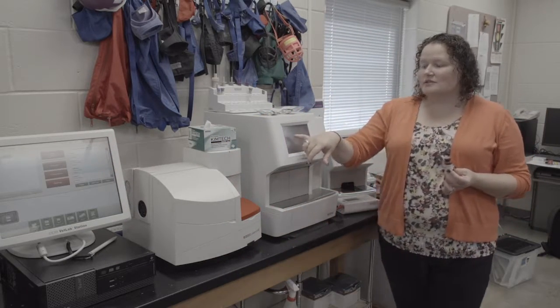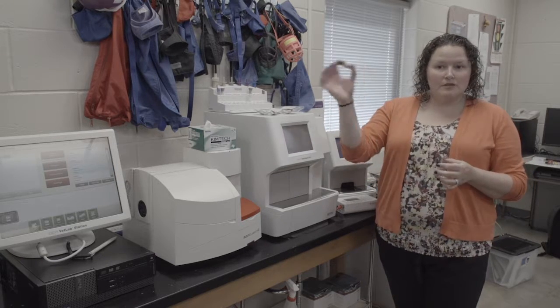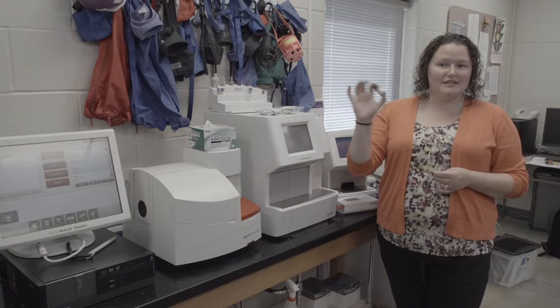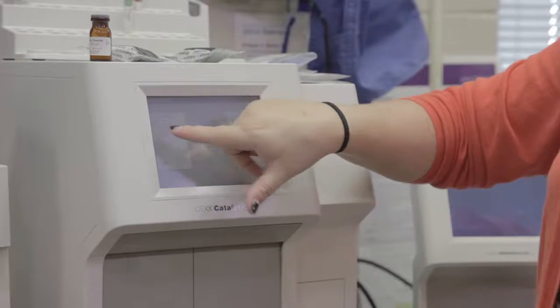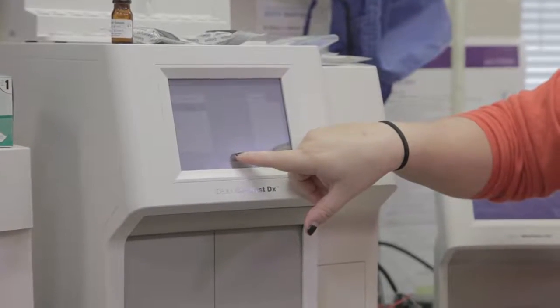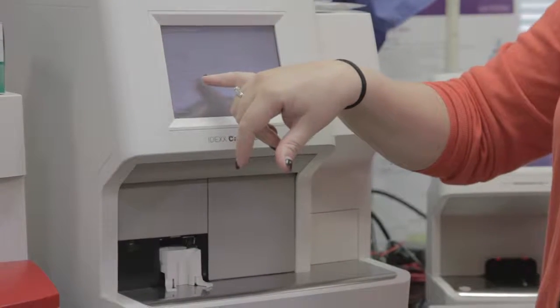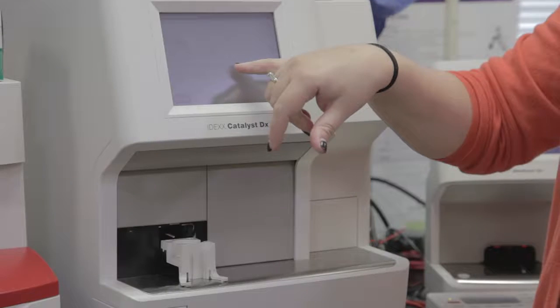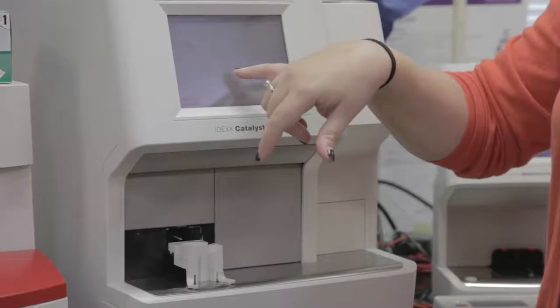Now that's sent this over to the catalyst just like it's a patient that we're going to run. You want to make sure that this has been mixing for 45 minutes, which it has. So we're going to tap on our QC patient and we're going to tap on load. Then it's going to open our drawer and tell us to load a catalyst sample cup containing 300 microliters of properly prepared Vetrol into the sample drawer.